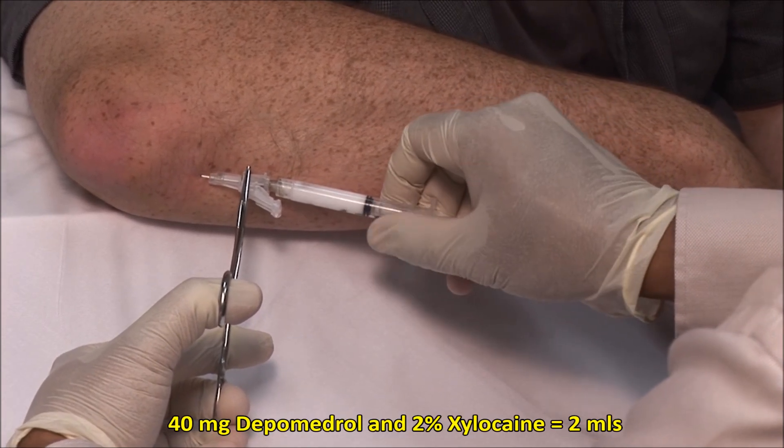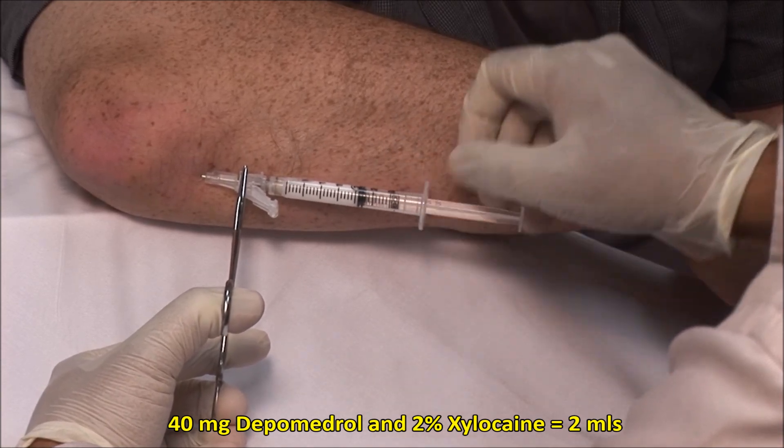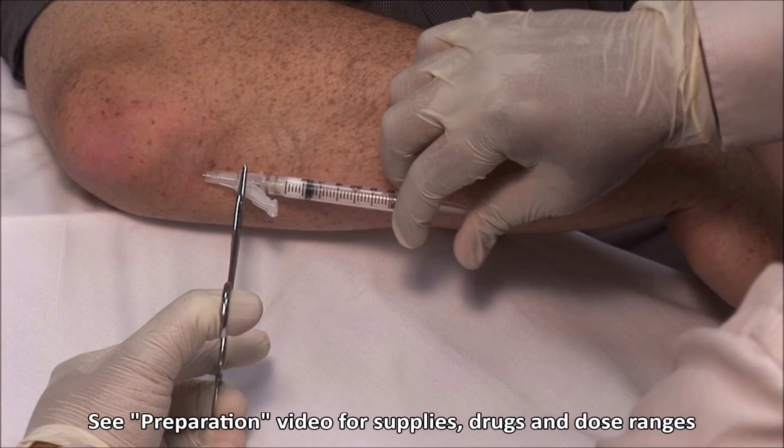Here, I am injecting a mixture of 40 mg of depo-medrol and 2% xylocaine made up to a volume of 2 ml. It should go in freely.